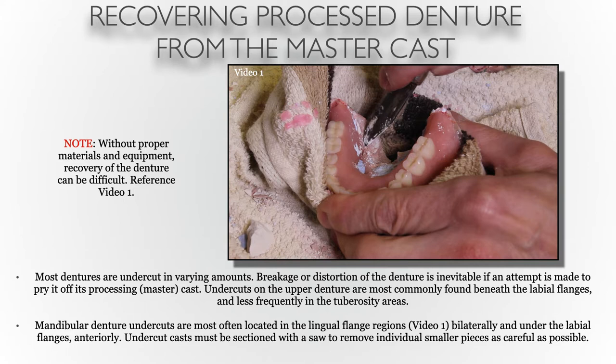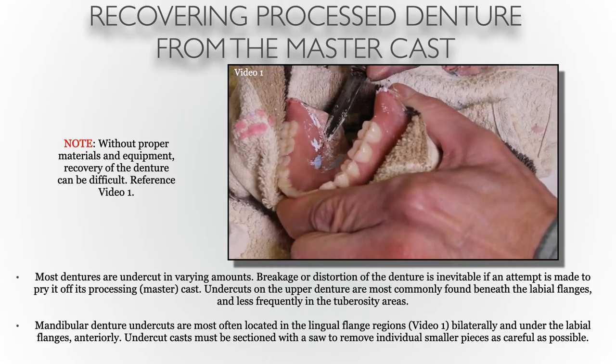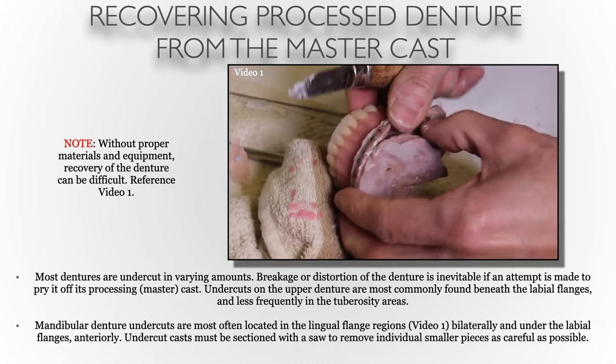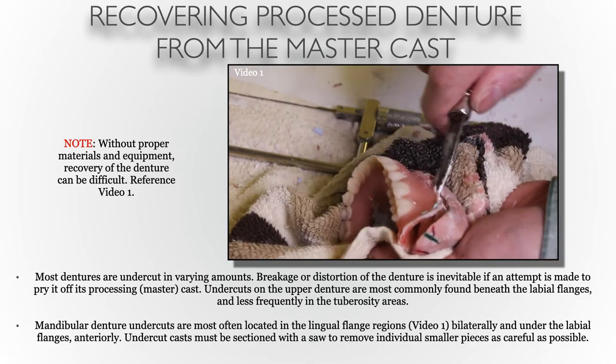Undercuts on the upper are more commonly found beneath the labial flanges, while on the mandibular denture they're more commonly on the lingual flanges as you can see in this video. It's important that in the absence of a pneumatic chisel, you pry from multiple different angles. If you try to pry a denture off a cast from one angle, it will grab undercuts and you will have a high probability of fracturing the denture base.